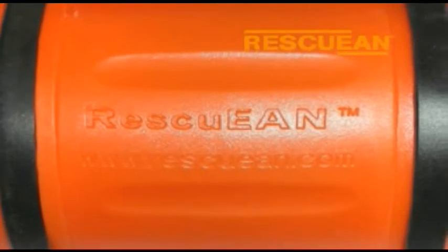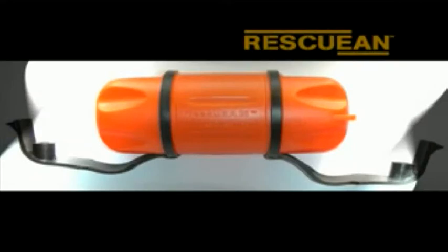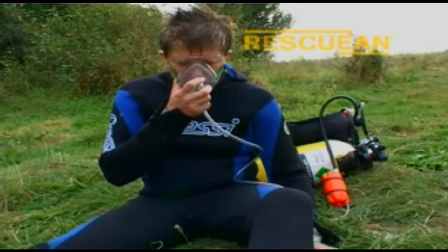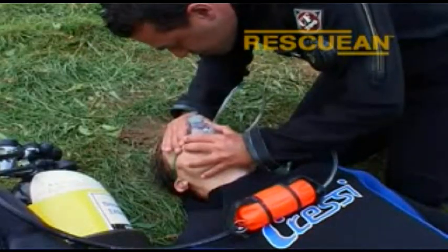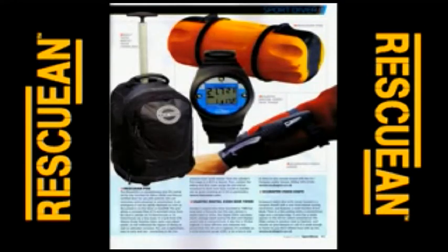Introducing the new Rescue EAN pod. It is a life-saving aid for the qualified diver finding themselves in a situation where an O2 kit is unavailable, already being used, or exhausted. It has been designed for use with a patient whether conscious, semi-conscious, or unconscious. The pod was launched in 2007 and has been well received by the diving press, diving associations, and divers of all levels.